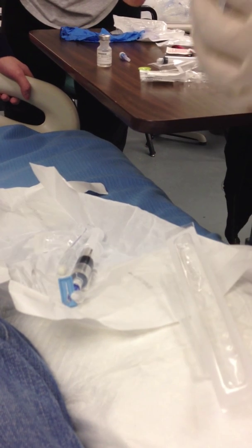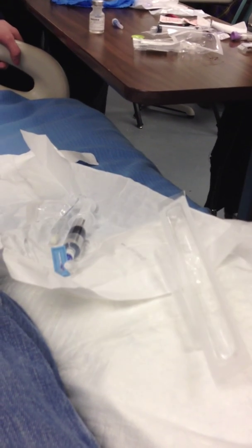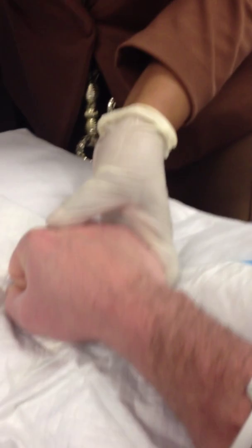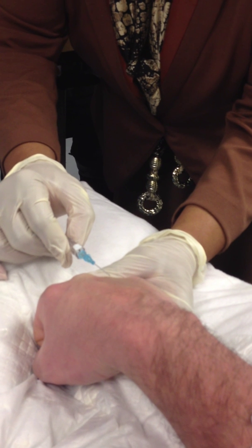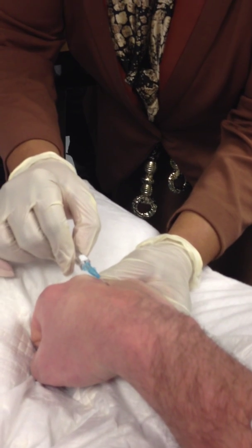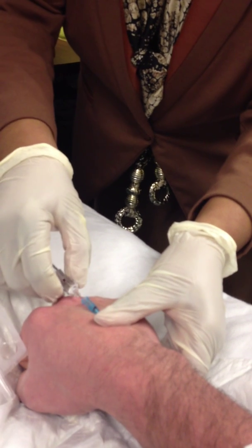Close your hand a little bit there. You want to rotate — keep the bevel up — but you want to rotate, make sure that the hub does not stick to the patient. Get a little stick. I'm going to thread it there. Pinch it off.